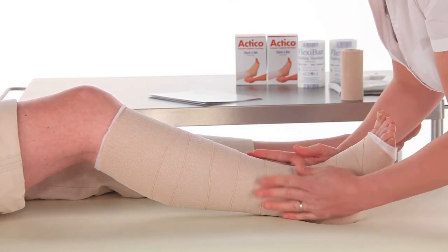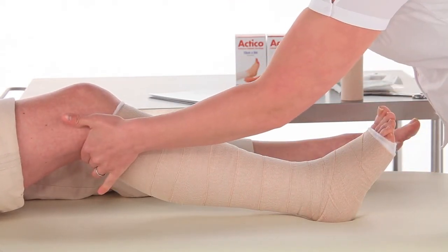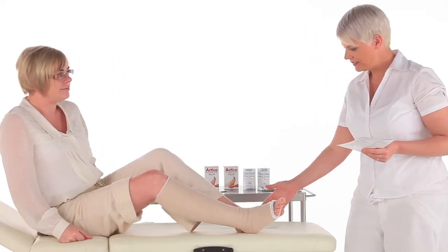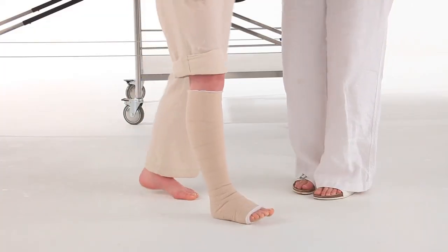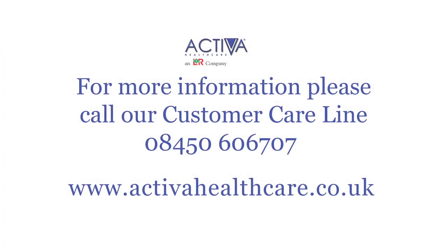Actico is capable of maintaining pressure without slippage due to the cohesive nature of the bandage. As with all compression bandage systems, training on the correct application is recommended. Actico offers free training and education, and if you require any further information before applying the Actico cohesive inelastic compression system, please contact our customer care line.